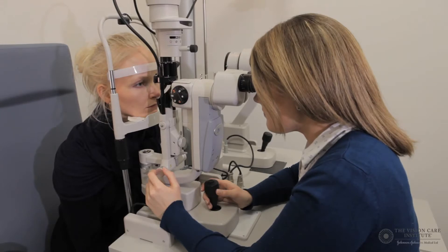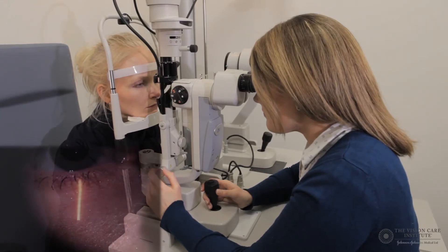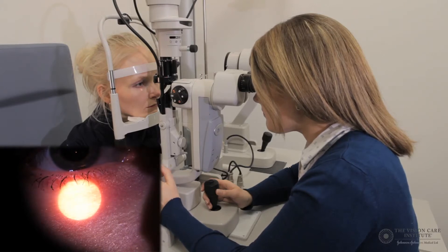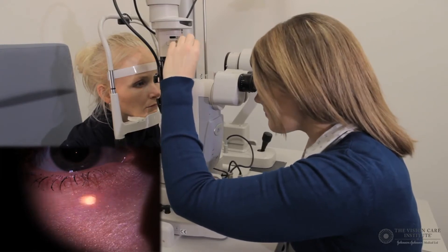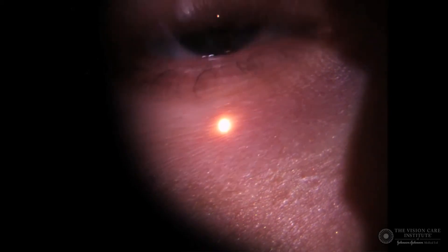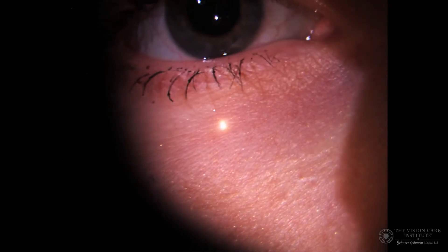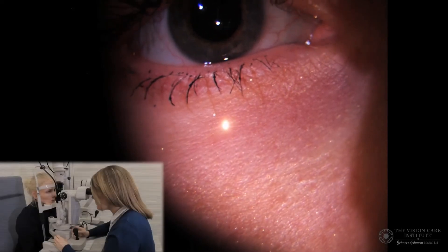In order to carry out this technique, the first thing we need to do is to form the conic beam. In order to do this, we need to form a circular patch of light. Here we can see that the aperture of the slit can be widened to create a circular patch. We then decrease the height of the slit until it generates a disc diameter of 0.2 to 0.5 millimetres.